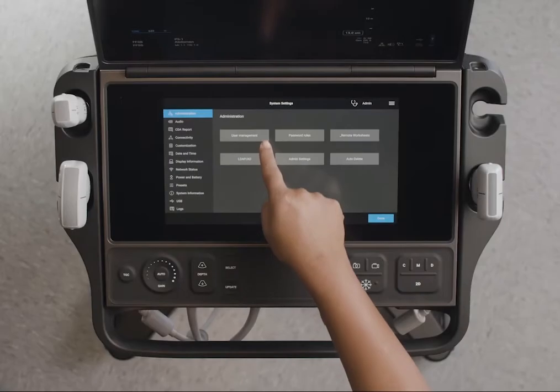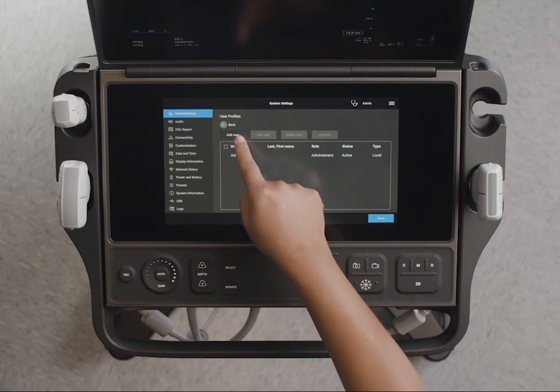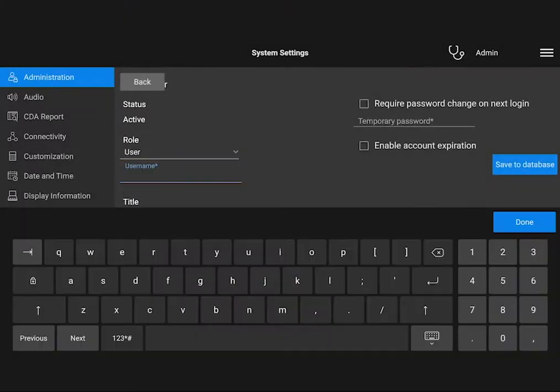To add new users, tap User Management and tap Add User on the next screen. Fill in the user information.